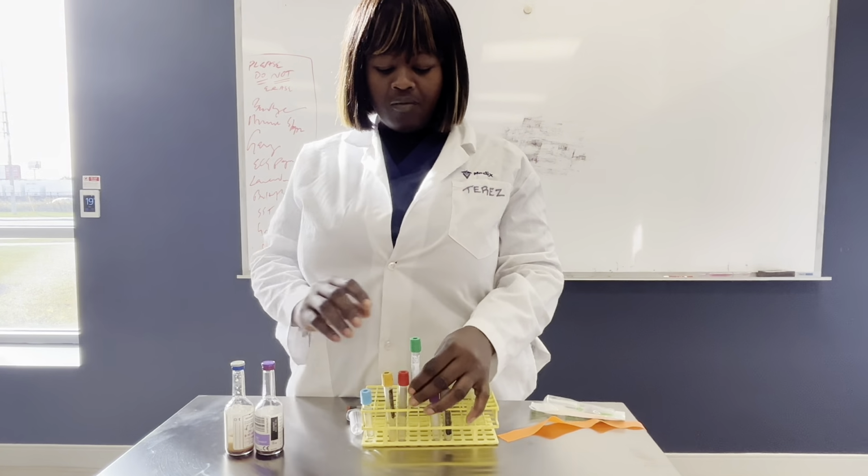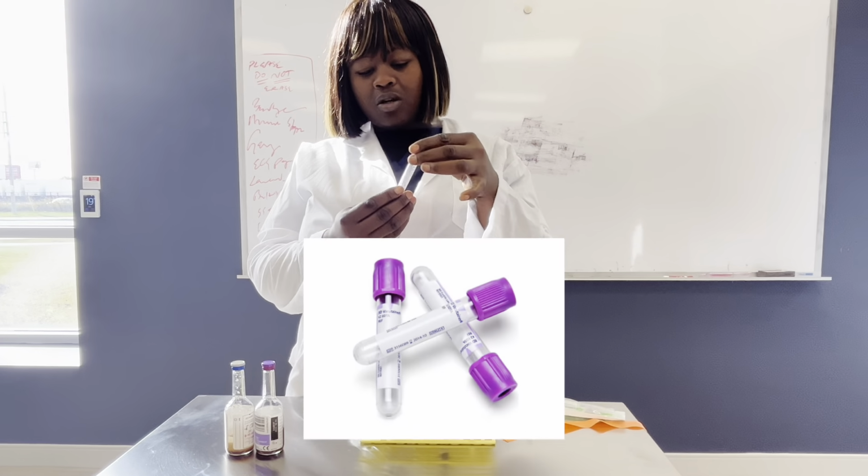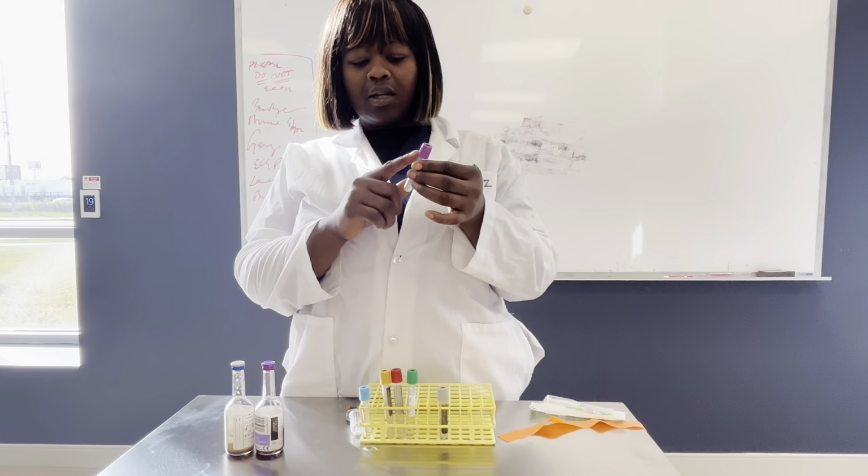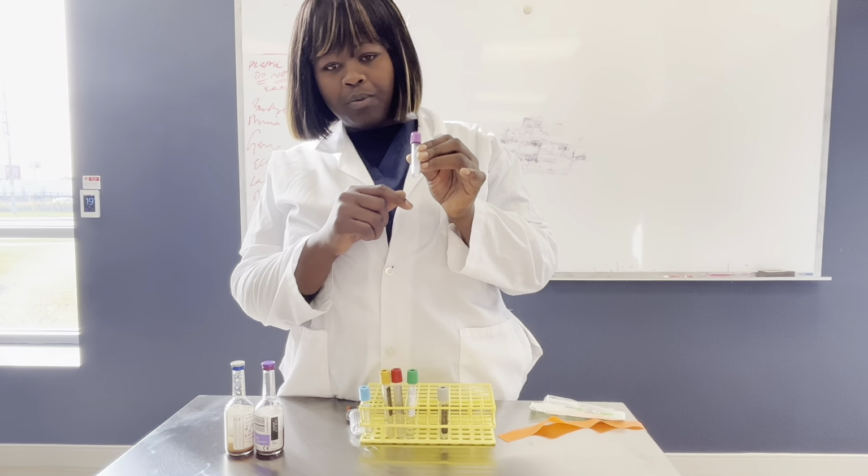So next in the order of draw, we have the lavender top tubes. This tube contains EDTA, so it's not a liquid, it looks as if it's a spray.